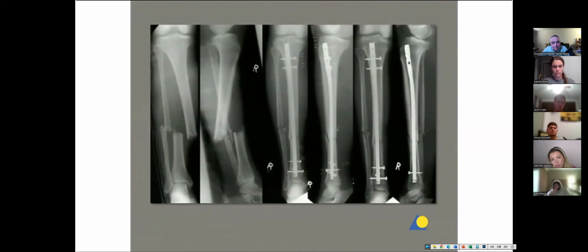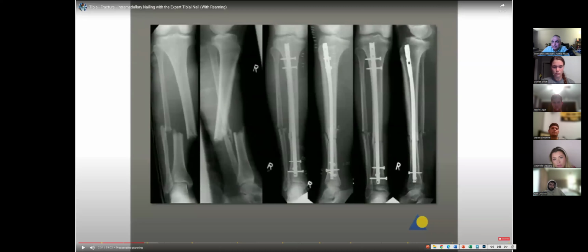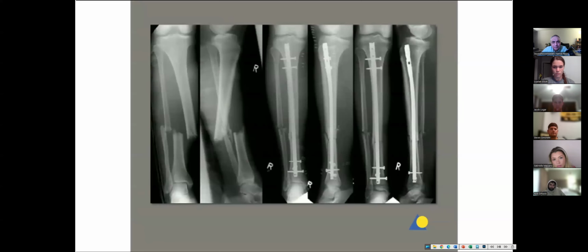With simple shaft fractures, 4 mediolateral locking screws are normally sufficient, 2 distal and 2 proximal. Secondary dynamization is achieved by removing the locking screw from the static locking option. In very proximal and distal fractures, additional interlocking is required.